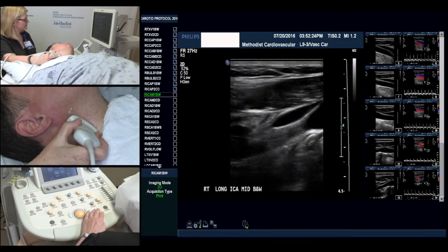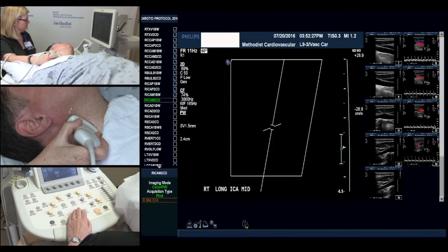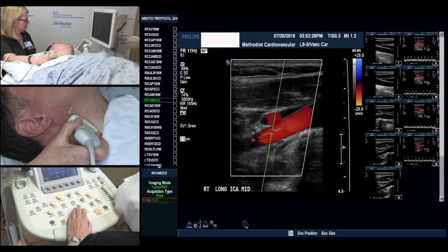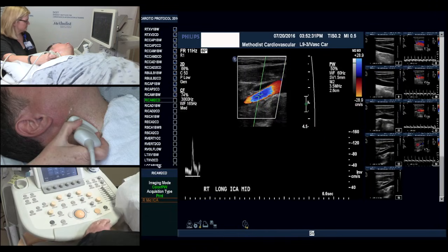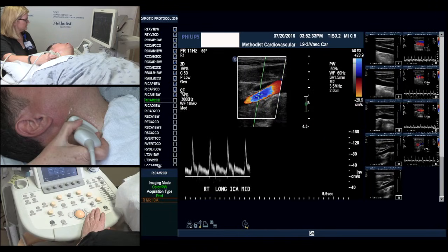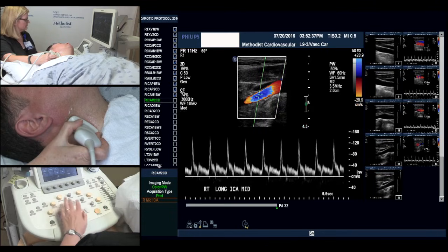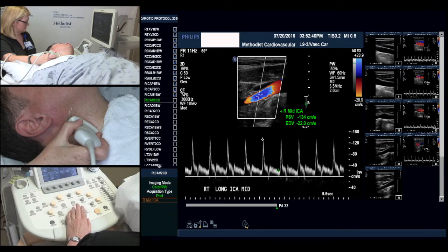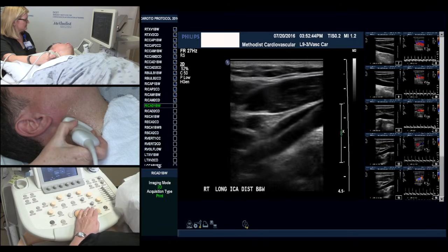We'll move into our mid internal, obtaining image and Doppler. And now moving into the distal internal.